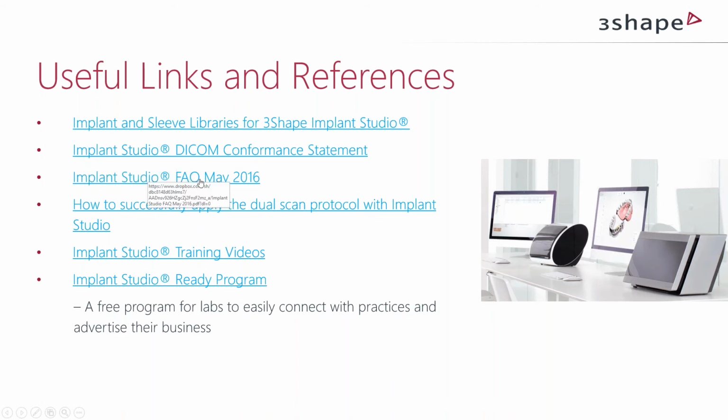Then frequently asked questions regarding this version of Implant Studio 2016. Then you may probably have heard already about Implant Studio 15 and 16 versions, that we now work with edentulous cases. In that workflow, we follow the dual scan protocol. On how to apply this protocol successfully in Implant Studio, we have an article here, a document. And here is the link to some training videos on how to use this software.